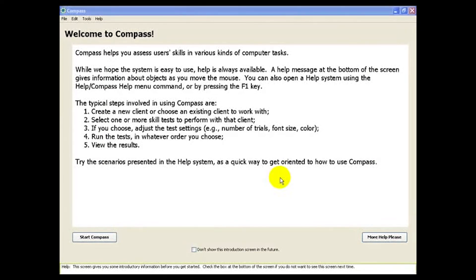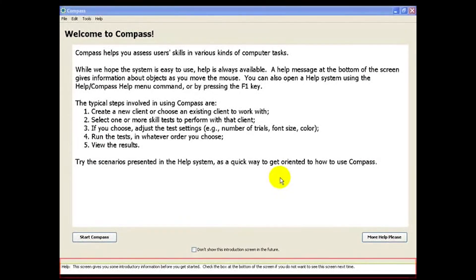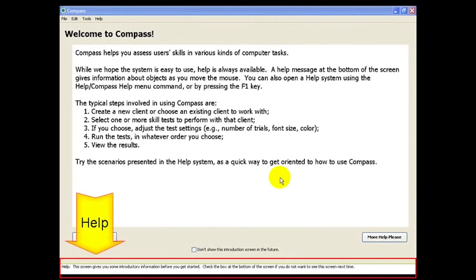Here's the opening screen of Compass. Note that you can get some help by looking at the help bar at the bottom of the screen.